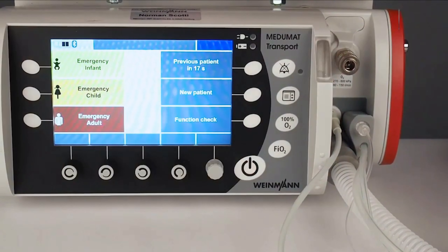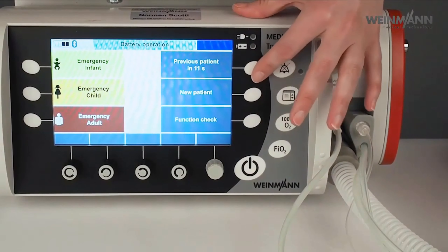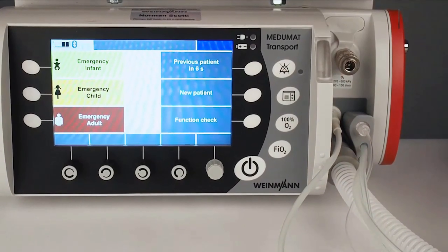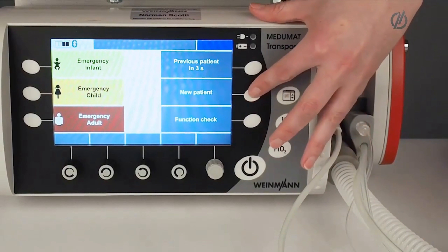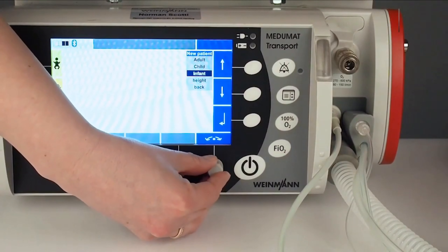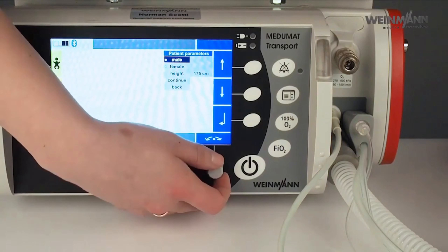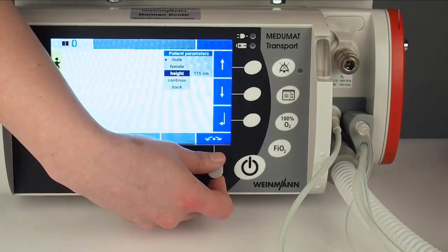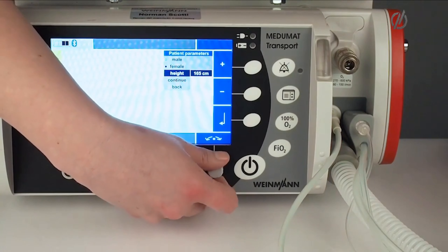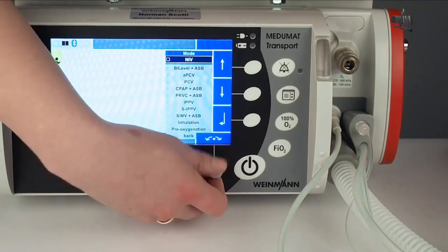Another way to start ventilation is via 'Previous Patient' — press that and the device starts with the settings of the last patient. For more specific settings, use 'New Patient.' You can either choose one of the three patient types or go via height. Here there is the possibility to enter the gender and height of the patient. I will choose female, with a patient height of 170 centimeters, then go to continue.